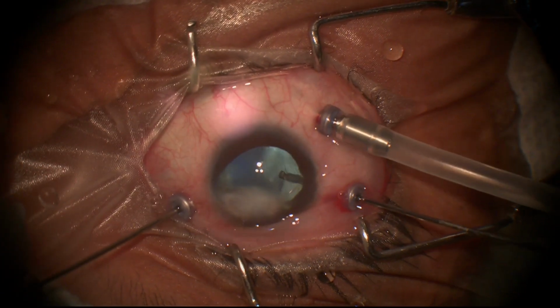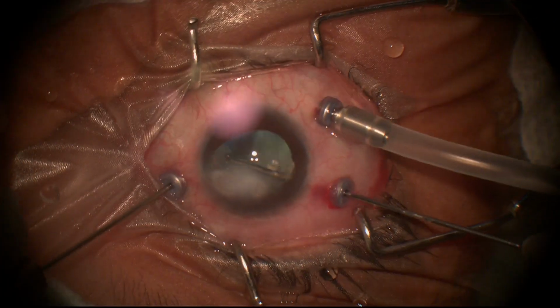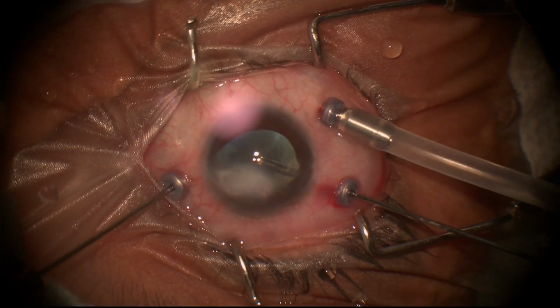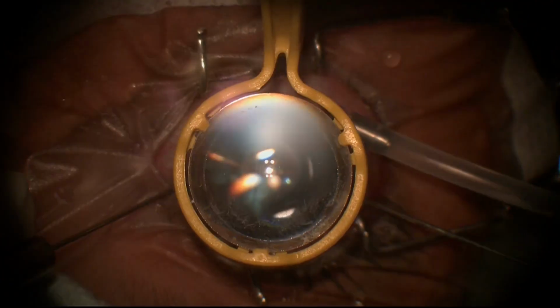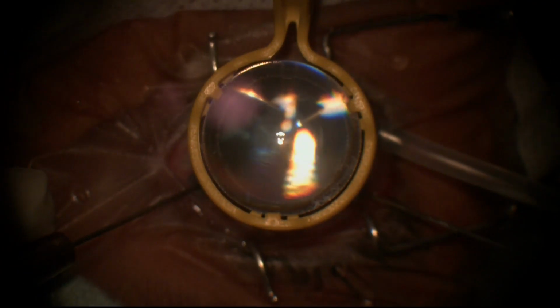I can massage this IOL to bring it back in position from behind. I'll just see if I can do it. You should do it after the vitrectomy. अरे बाद में क्या फ़ायदा, करना है तो अभी करो, so that you don't have an issue with the view.